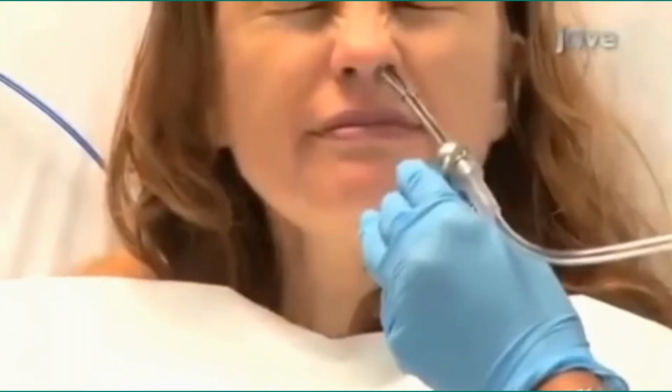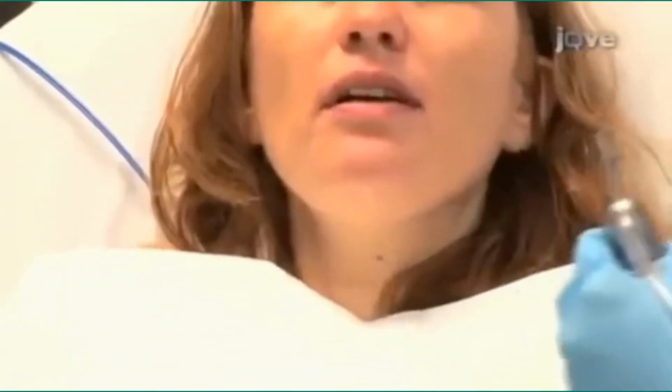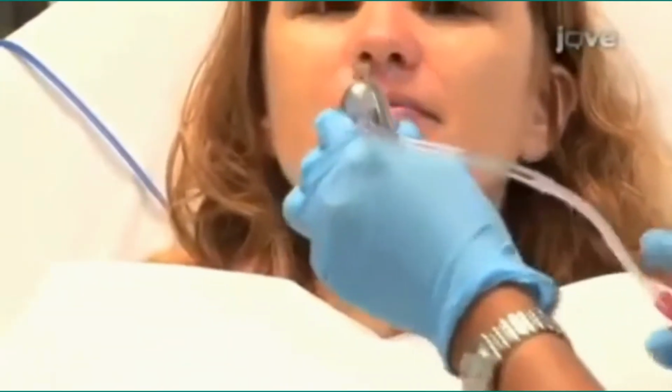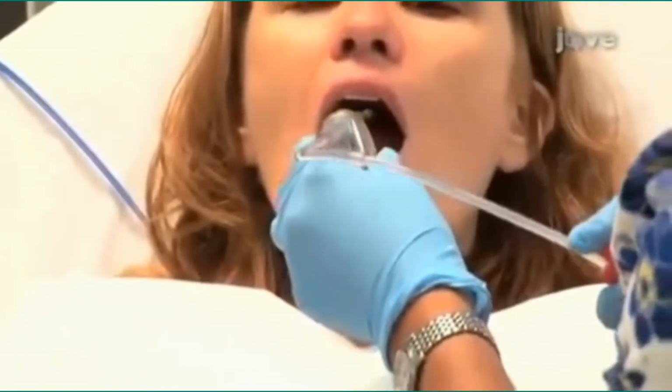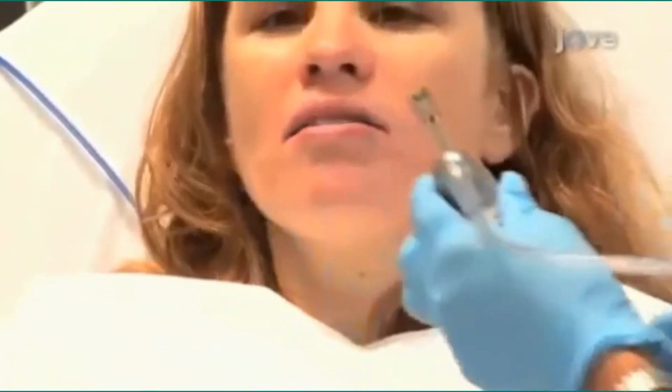Additionally, judicious application of topical anesthesia such as lidocaine is used during the procedure to control the airway reactivity. The patient's nasal passage, posterior pharynx, vocal cords, and bronchial tree are anesthetized.